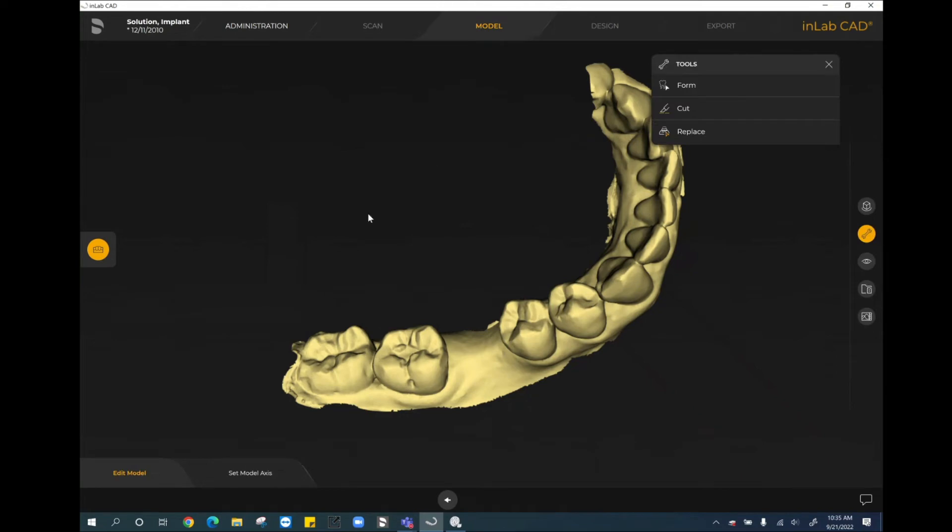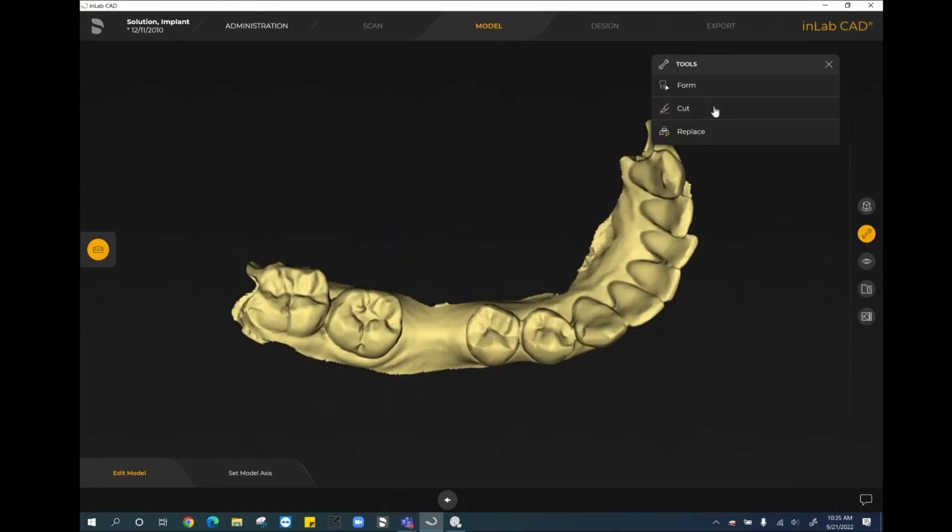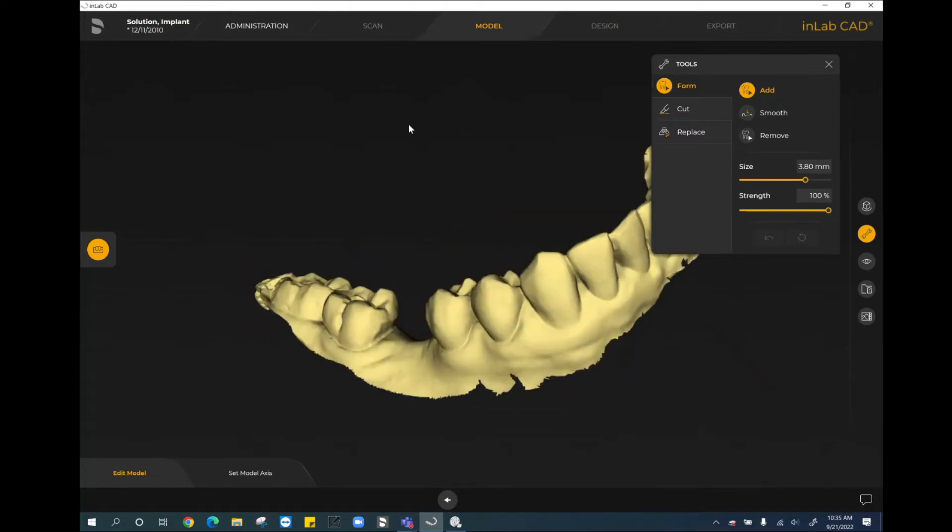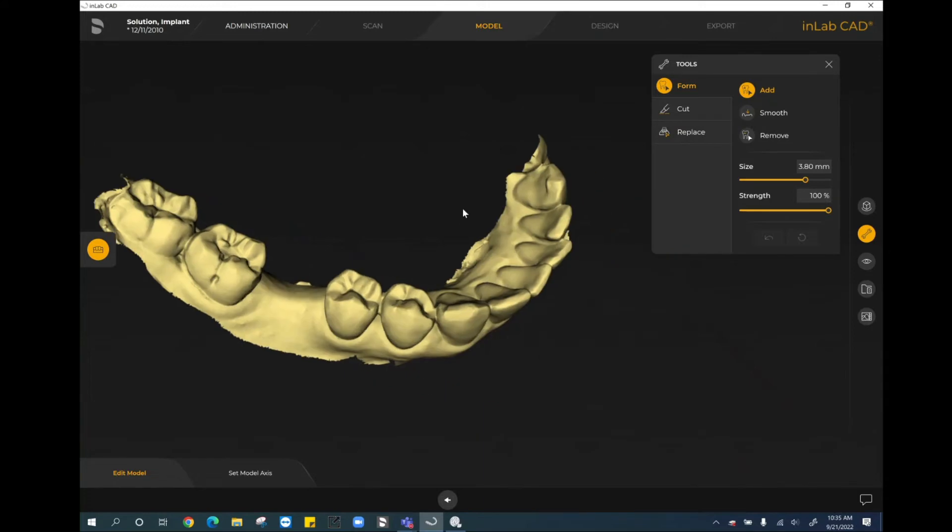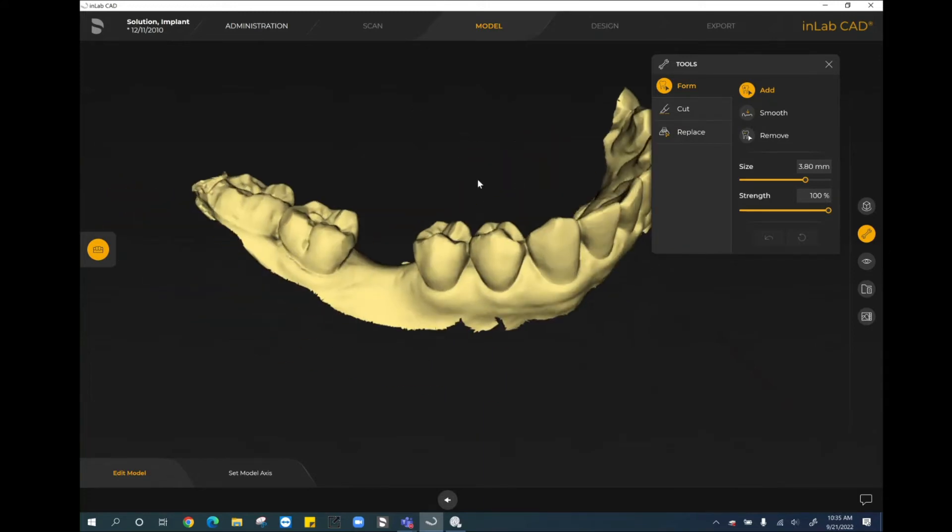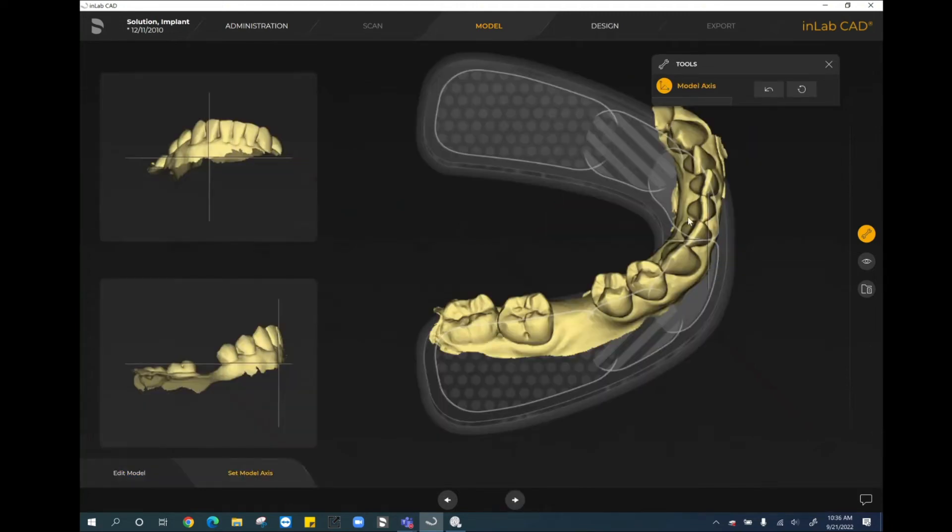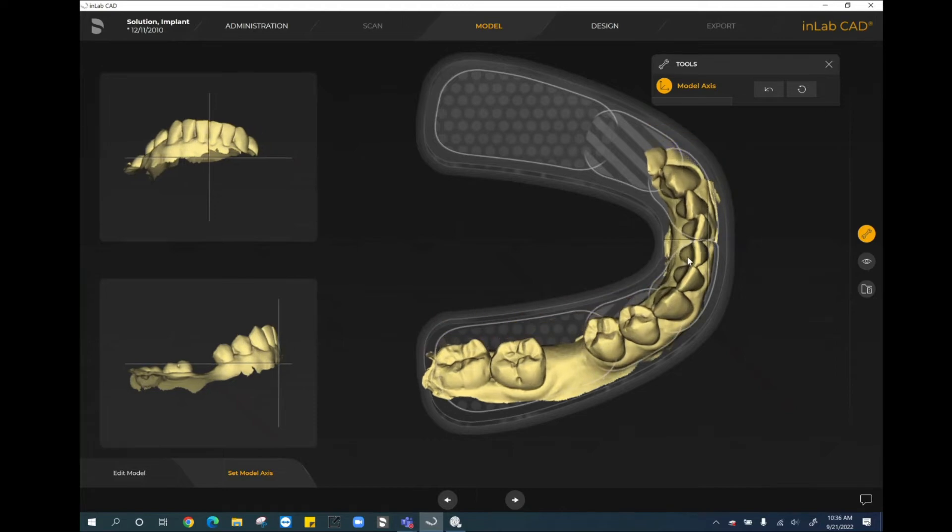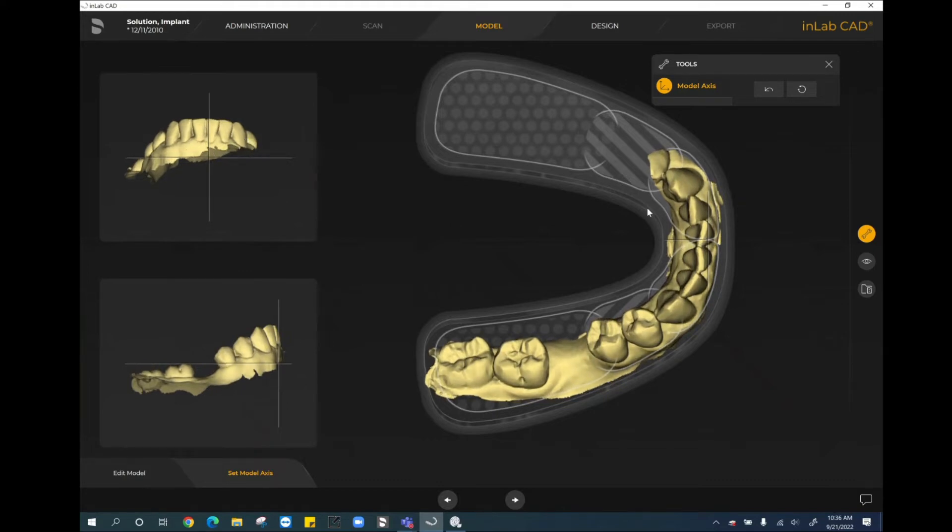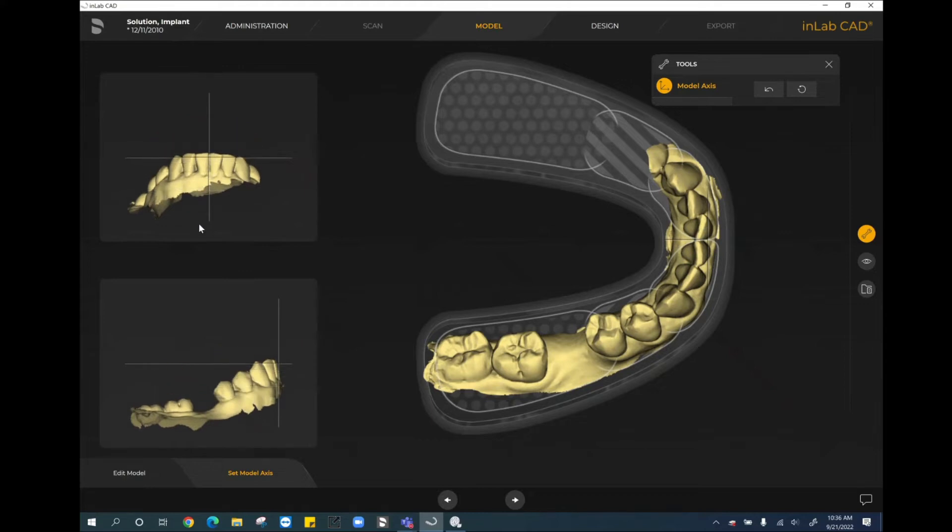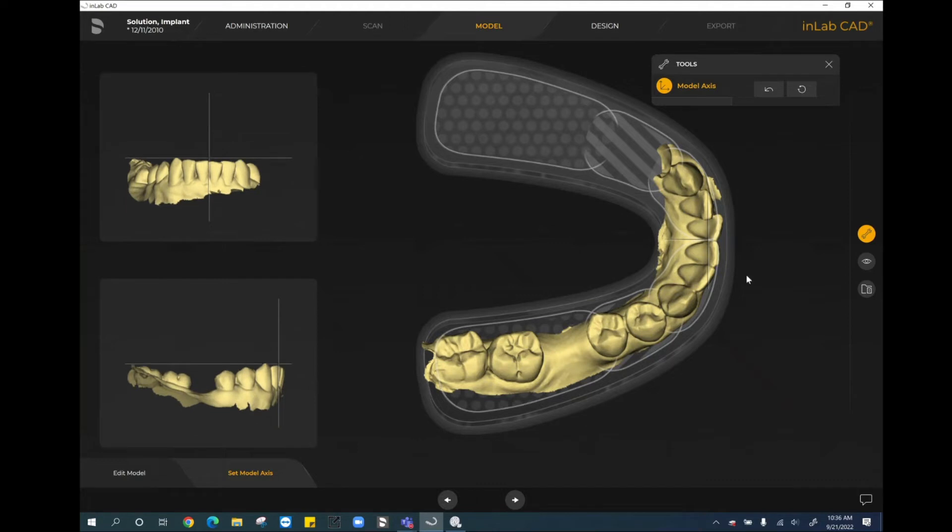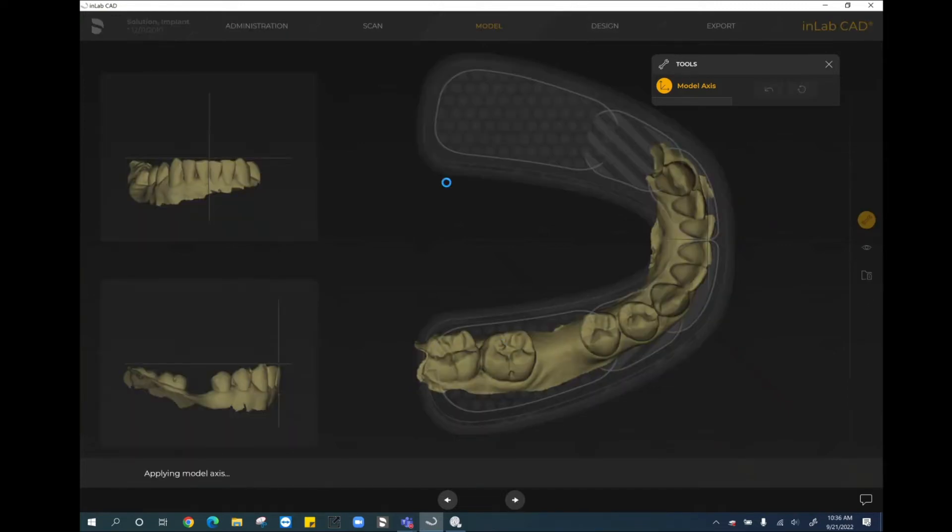At this point in time, we can move forward to the model phase of the software. As soon as we come in here, the edit model step, just like in any other version of InLab or CEREC, we have the ability to use the form tool to add, smooth, or remove material. We have the cut tool available to us to trim anything away that we may not want to be a part of the guide. And we also have the replace tool available, should we need to fill in any small holes or anything like that. If there's nothing to do, we can go ahead to set model axis. And again, this step we're very familiar with, we want to use our left cursor first to pull this into the arch itself. And then we can go ahead on the right hand side of the screen, or the left hand side of the screen, and move this model up down accordingly.